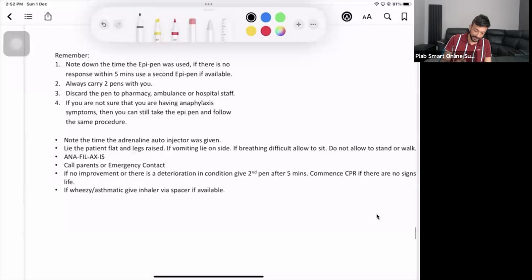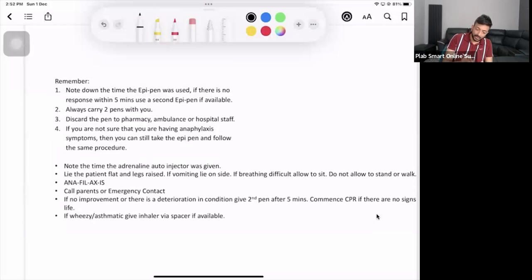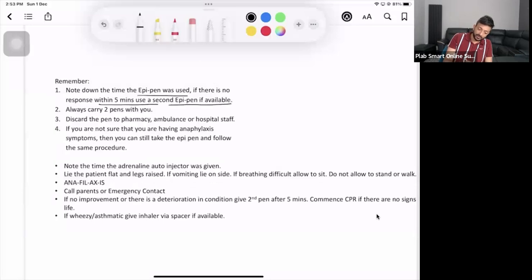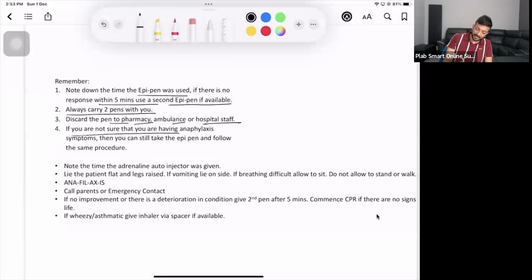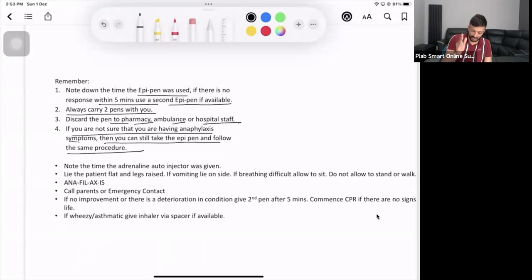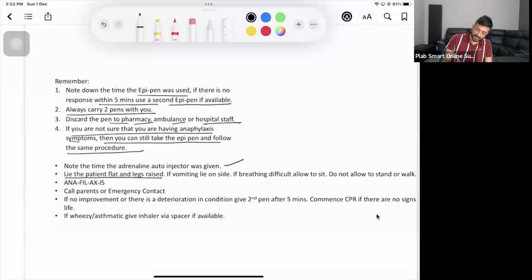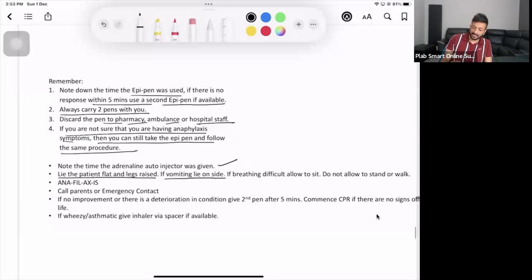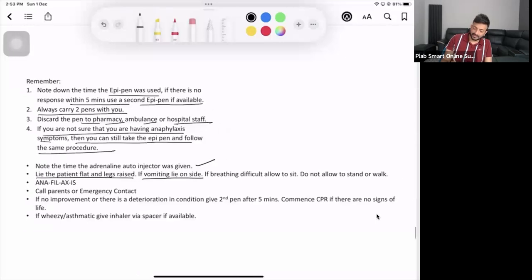Remember, note down the time when the EpiPen was used. If there is no response within five minutes, use the second EpiPen. Always carry two EpiPens with you. Discard the pen to the pharmacy, ambulance, or hospital staff. If you're not sure they're having anaphylaxis symptoms, you can still take the EpiPen and follow the same procedure. If you're in doubt, is it allergy or anaphylaxis, should I give EpiPen or not? Give it. Note the time the adrenaline auto-injector was given. Lie the patient flat with legs raised. If vomiting, lie on the side. If breathing difficulty, allow to sit. Do not allow to stand or walk.